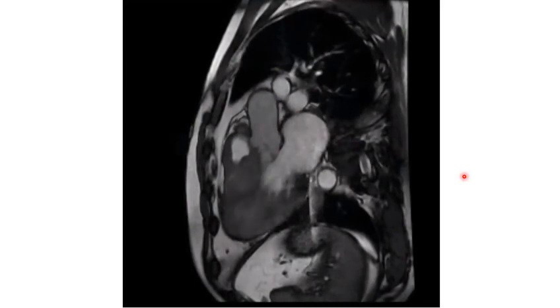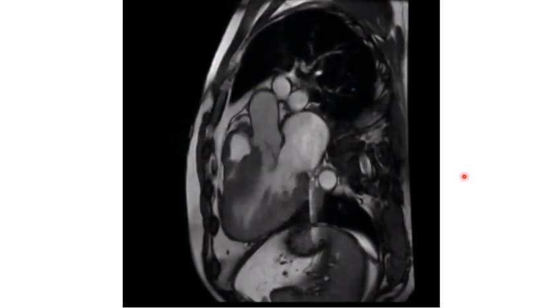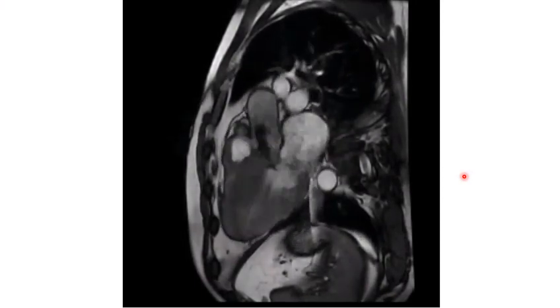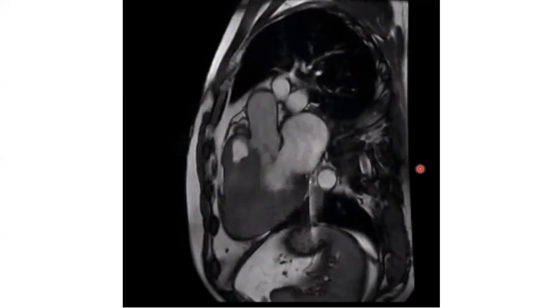Diagnosis. HOCM. Along with, it is not only HOCM. With SAM. With SAM and? MR. MR, yes. You can make out the mitral regurgitation, you can make out the SAM, and this hypertrophic obstructive cardiomyopathy. What is this, MRI? Oh, yes, sir, cardiac MRI, three chamber. Okay, right. Very good.